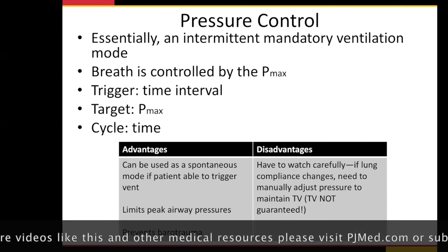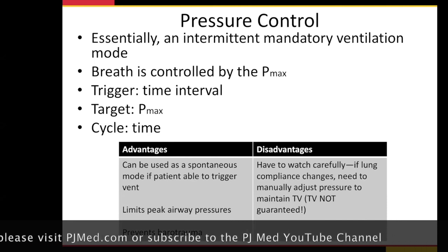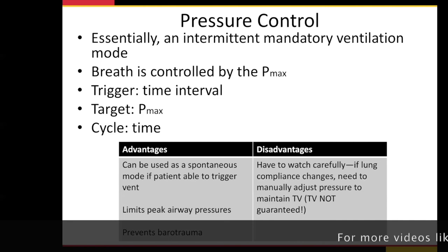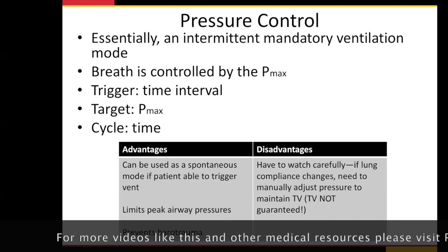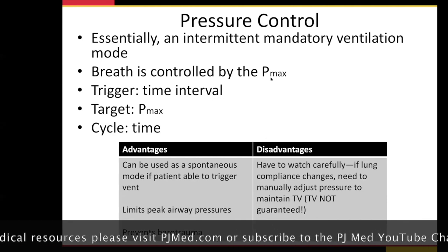So what you can do is use this mode called pressure control, and you can say, all right, I'm worried about my tidal volume. There's a tidal volume I want to achieve, but I'm going to control that by dialing in the pressure, watch the ventilator, and see if that pressure helps me achieve the tidal volume. So your breath is controlled by the pressure that you dial in, not the volume.